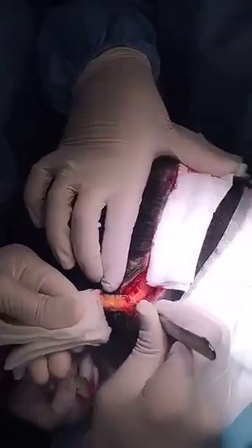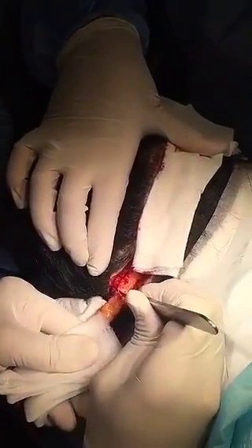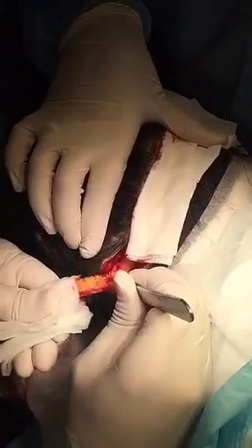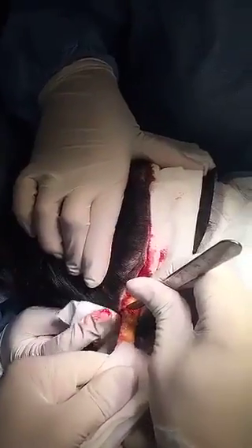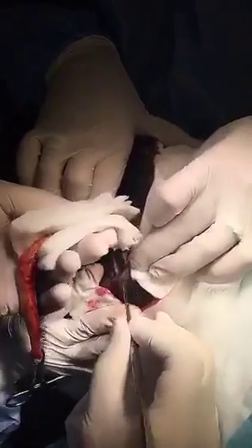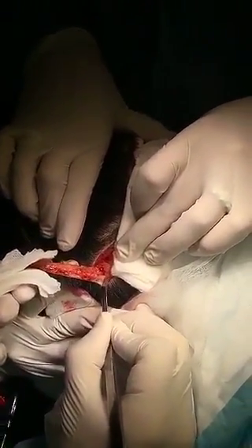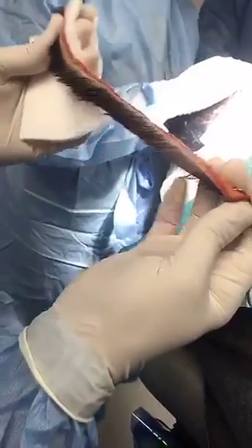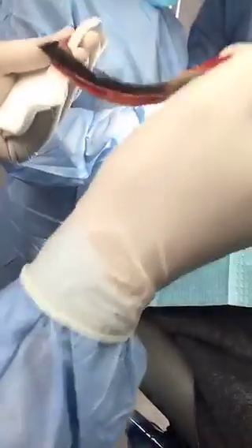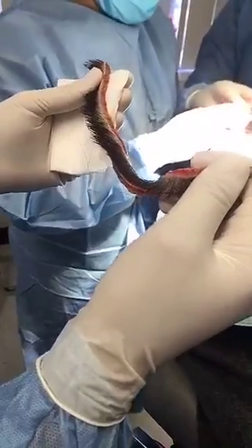The strip of the skin, it's almost out. We do it sequentially. We call it sequential strip removal. It allows the surgeon to remove half of the strip and leave the remaining in, so we don't have to remove everything. Skin that was removed with hair, we keep the hair long, and we're going to harvest the grafts under microscope, and they're going to be transplanted on the balding area.